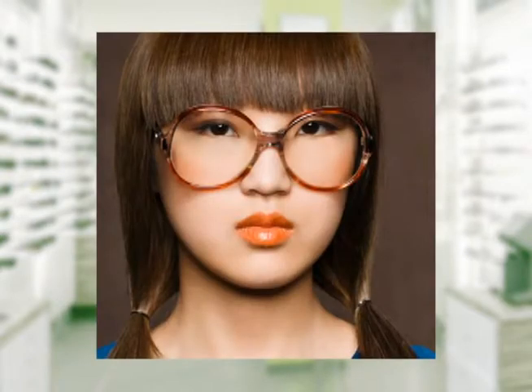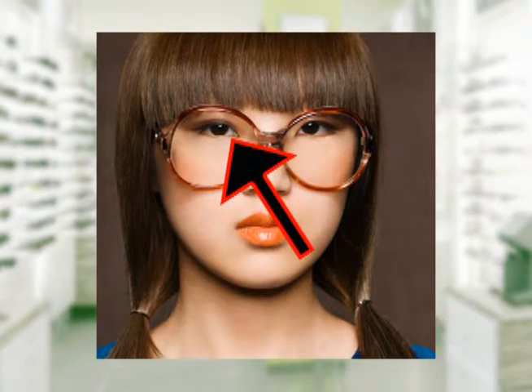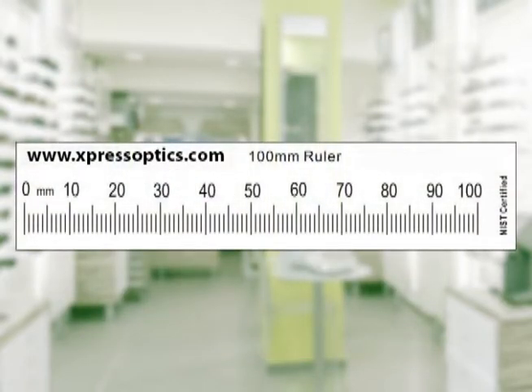Let's take your measurements. We need the pupillary distance — that's the distance between your two pupils. We also need the optical center or segment height, that's the distance between your pupil and the bottom of the frame that you selected. We have a downloadable PD stick on ExpressOptics.com that you can print out and do these measurements with.